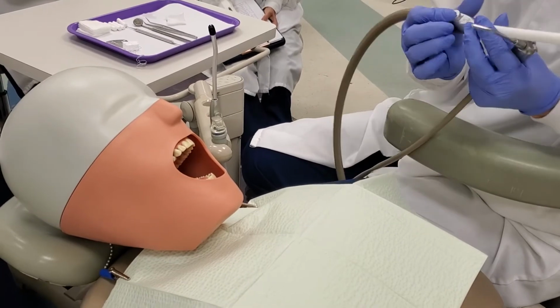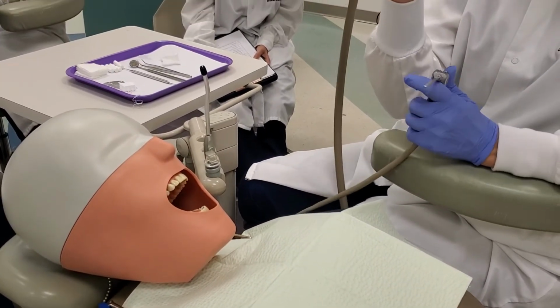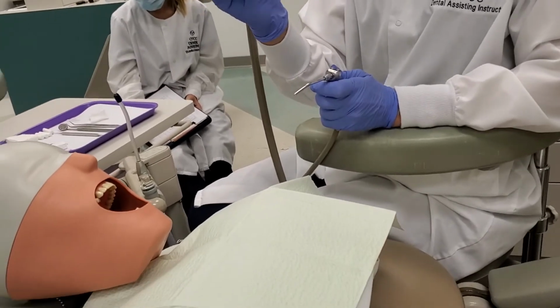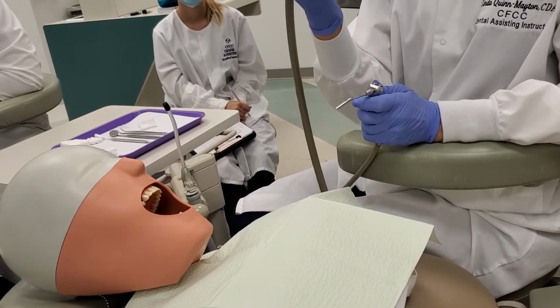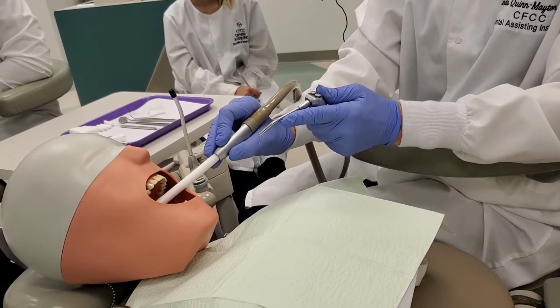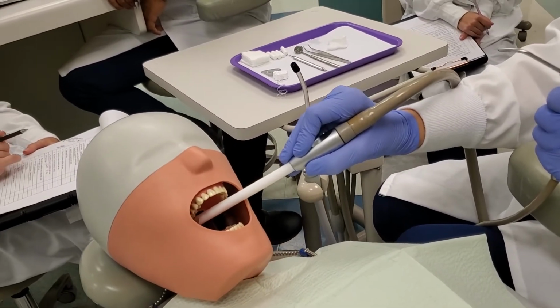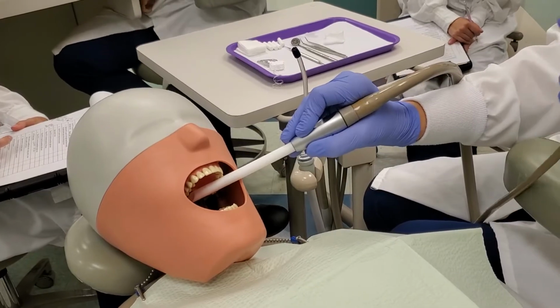Okay, so hold the HVE control in the right hand, always using the palm-thumb grasp when retracting the tissue. Hold the HVE control using the pen grasp. Open the control valve. Place the HVE to clear the maxillary right area. So maxillary right is the pen grasp. Okay, so that's it right there. The HVE bevel edge is parallel to the tooth, it's pointed towards the back, and it's not touching the tissue.